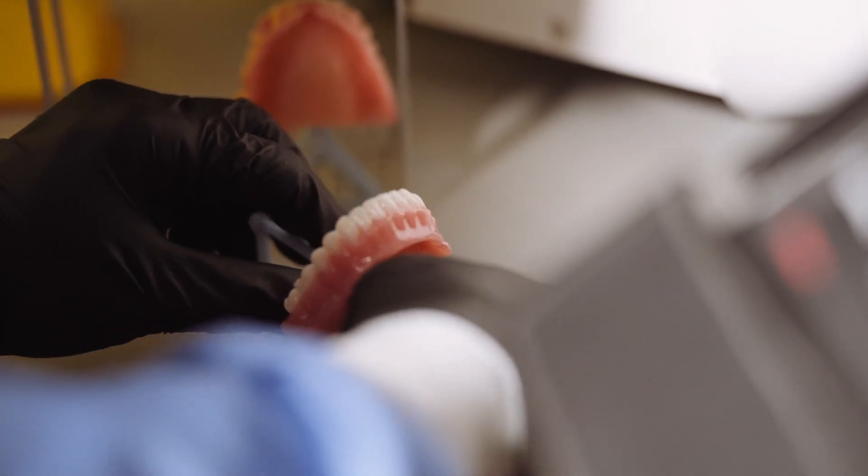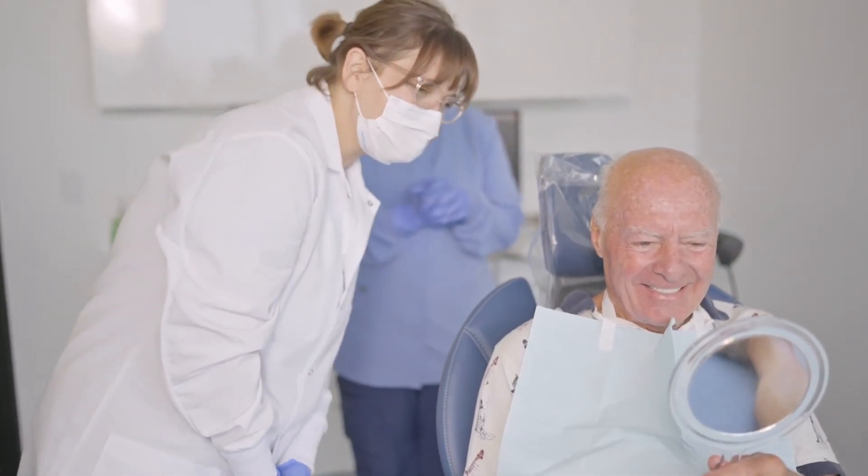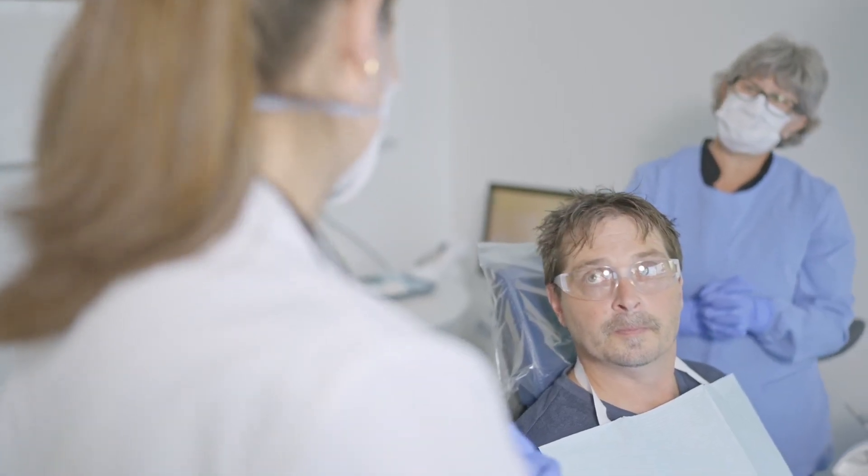The very powerful technological workflow that I can present to the patient, we can give them beautiful dentures that's functional and beautiful and aesthetic. It's great that you can tell your patients that when they put it in their mouth and it warms up it's even stronger.